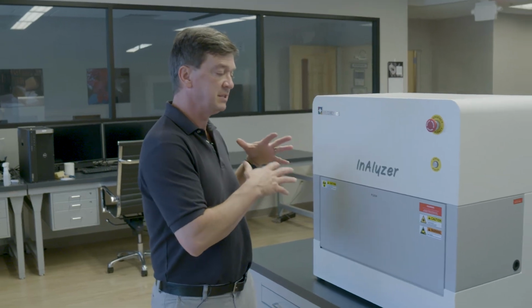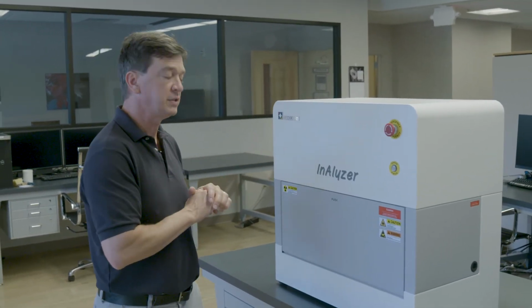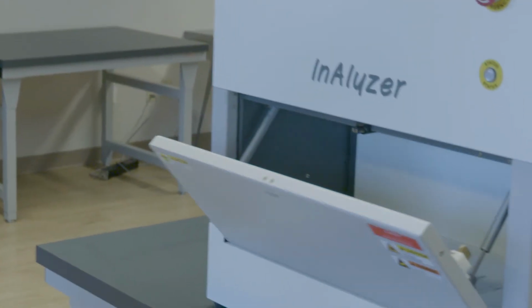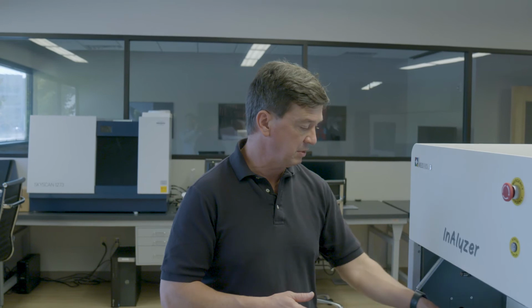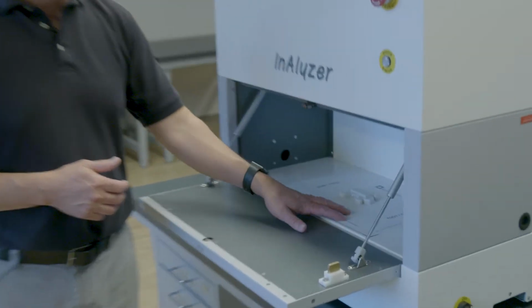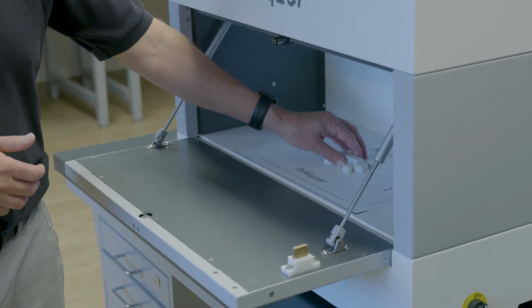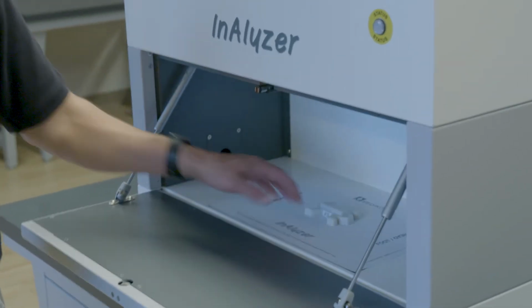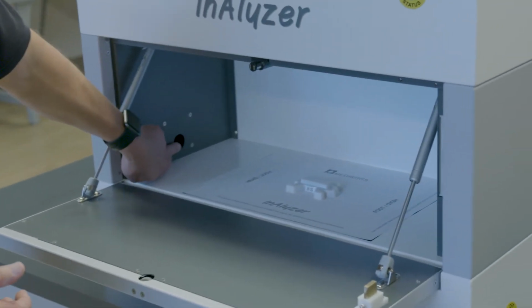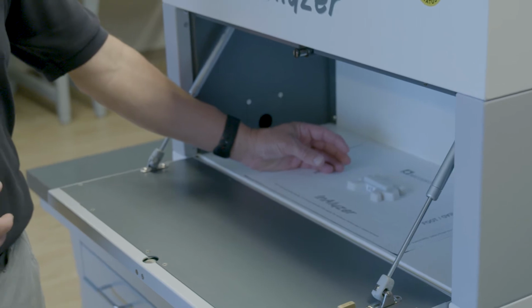So here we have the InAlyzer, and the great thing about this is it's a fully shielded system, so we can be standing next to it while we do the scans, and we're completely safe doing so. We just push the door and it opens up our sample chamber, and here is where we have the paper that will switch out between scans. We put our sample in, so the mouse can go either head to foot or foot to head. There is a port here to allow for an anesthesia tube to come in so that the animal can remain under during the entire scan.